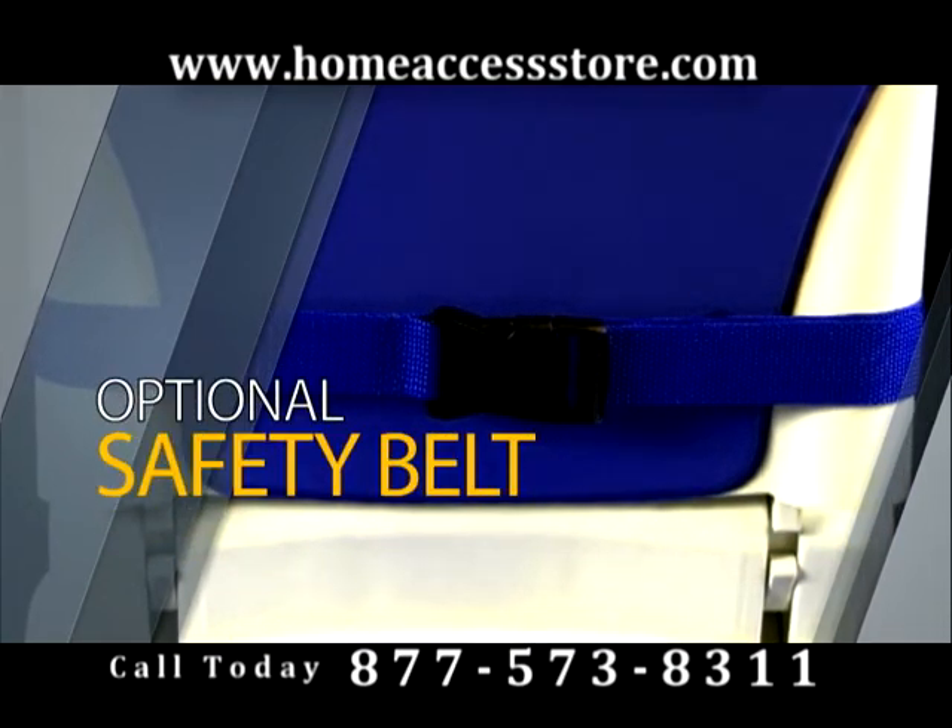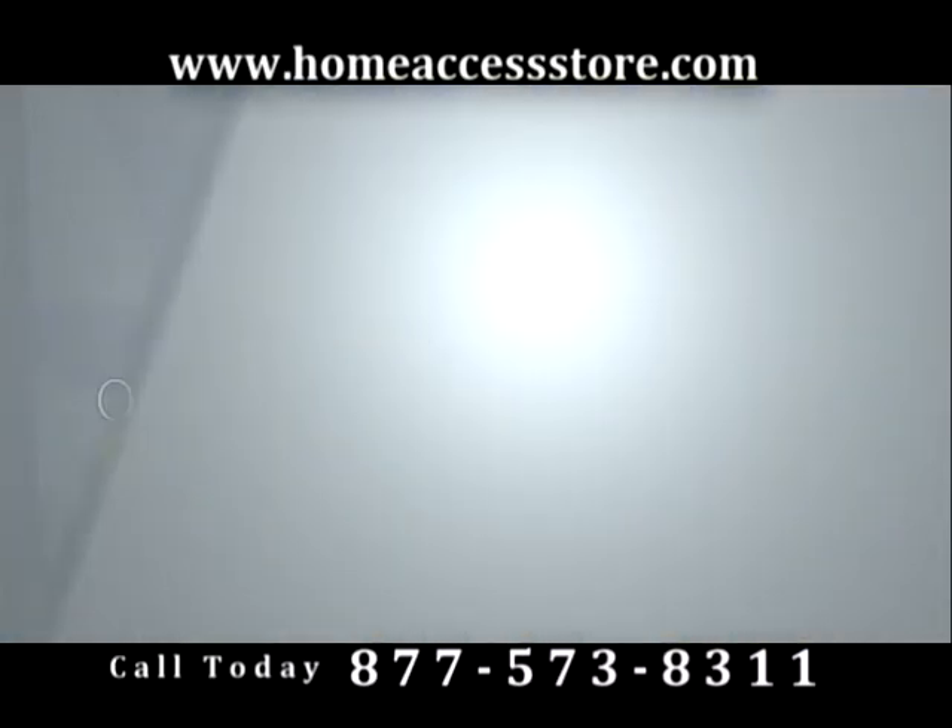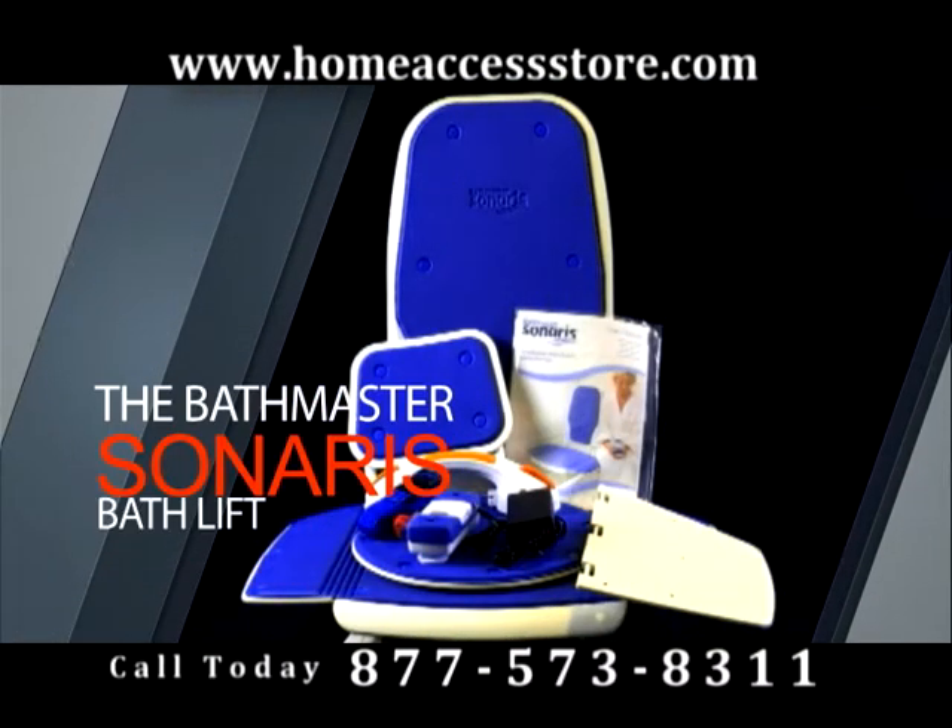Lightweight, durable, comfortable, safe and therapeutic. The Sonaris Bath Lift.